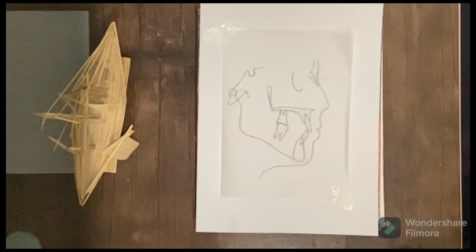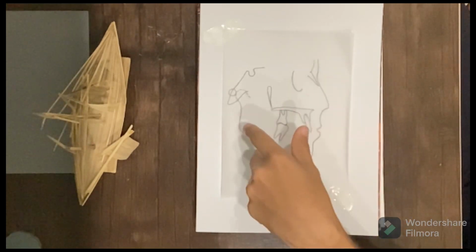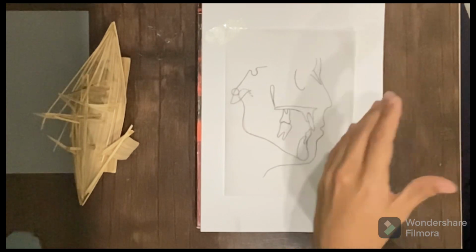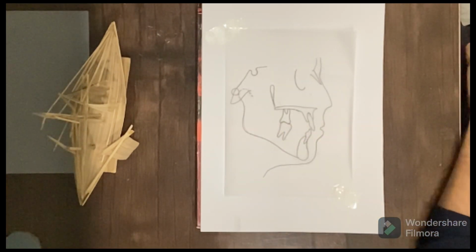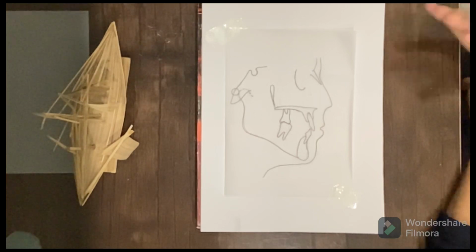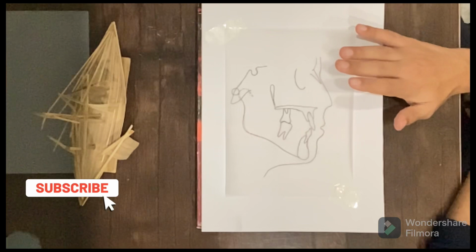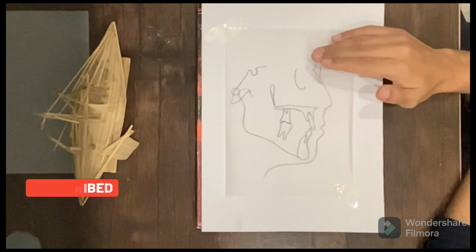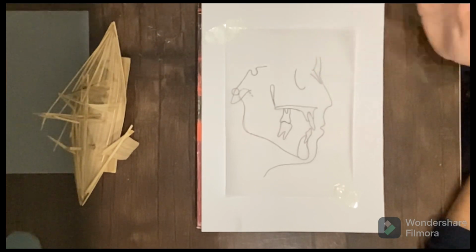Today we will discuss an important branch of orthodontics, which is cephalometric analysis. Cephalometrics is a very useful approach to study the variation of growth among individuals. By definition, it is one of the branches of orthodontics that deals with the study of the skull in different aspects in order to determine the skeletal, dental, or soft tissue changes that can affect the occlusion, and it is one of the mandatory records to diagnose orthodontic problems.